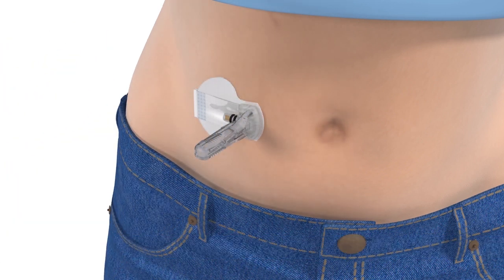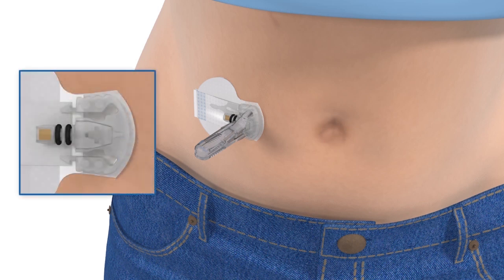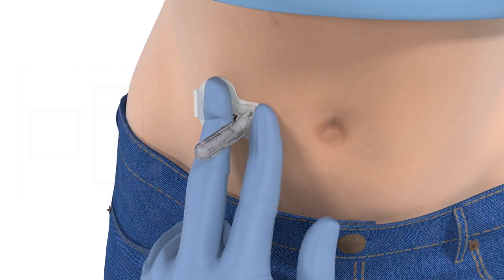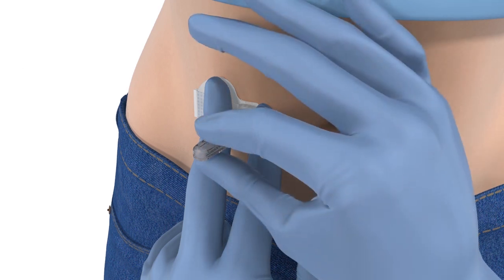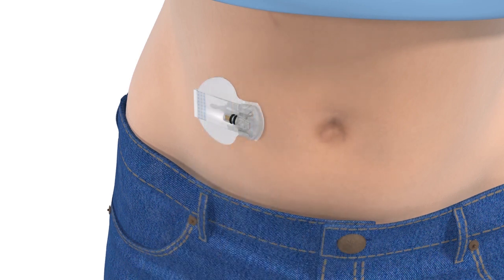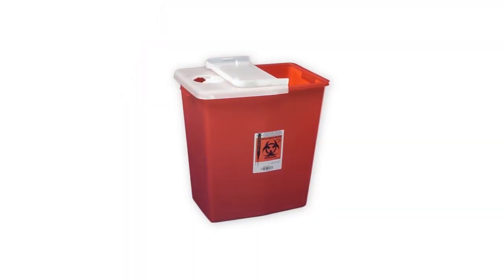With one hand, gently hold the sensor in place. Put one finger over the black O-rings and another on the opposite side. Be careful not to pinch the sides of the sensor, otherwise you may have trouble pulling out the needle. With your other hand, pull the needle straight out. You'll notice the needle automatically retracts. Discard it into a sharps container.